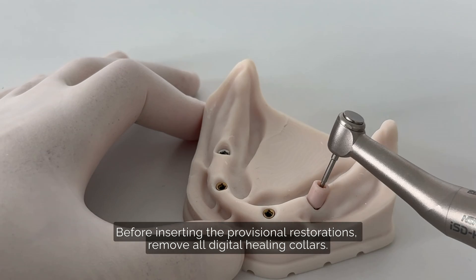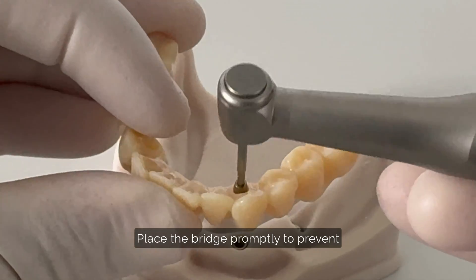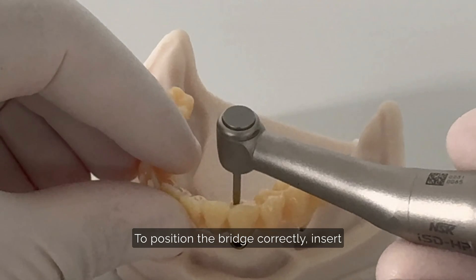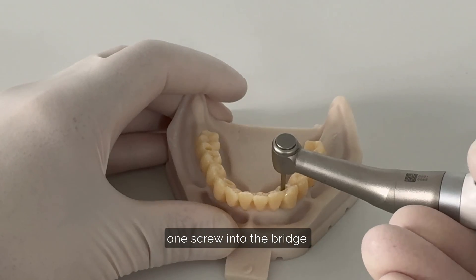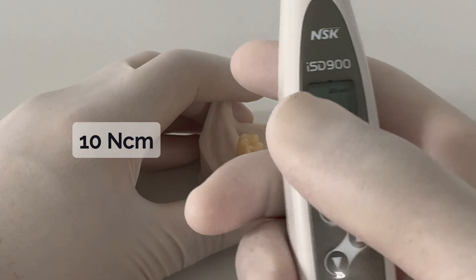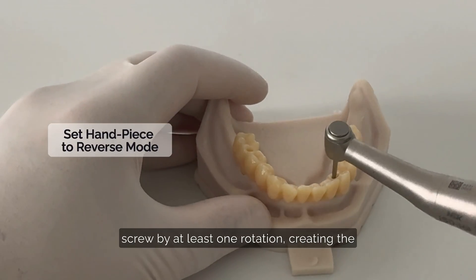Before inserting the provisional restorations, remove all digital healing collars. Place the bridge promptly to prevent the soft tissue from collapsing. To position the bridge correctly, insert one screw into the bridge. Once you reach 10 newton centimeter, reverse the screw by at least one rotation.